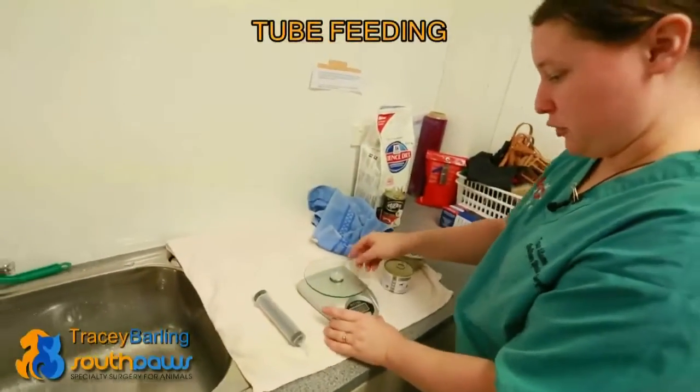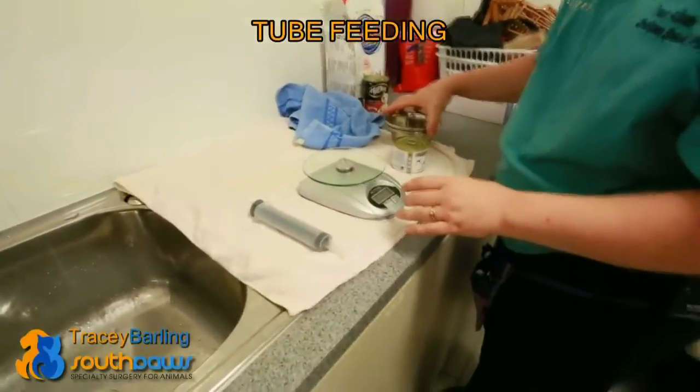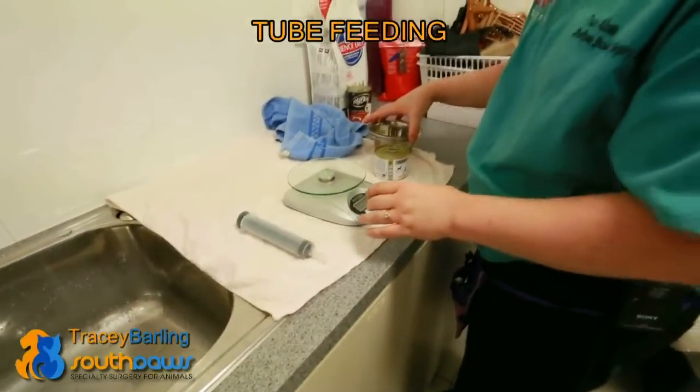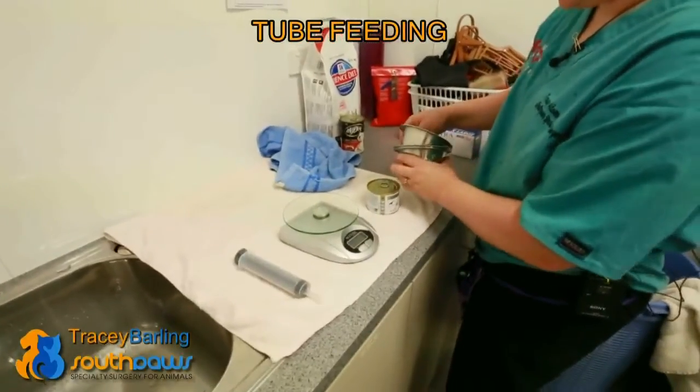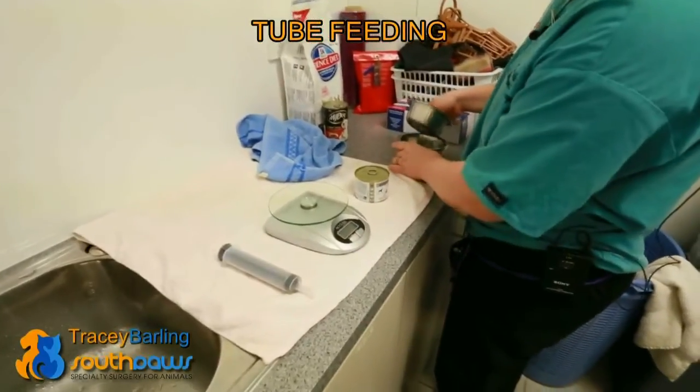I'm making up some food to feed this cat Jinx, who had a dorsal rhinotomy. We took some tissue from the top of his nose, and most cats need to be able to smell their food so that they eat.